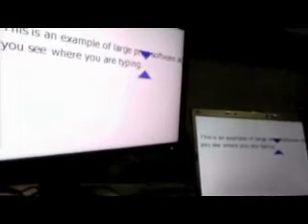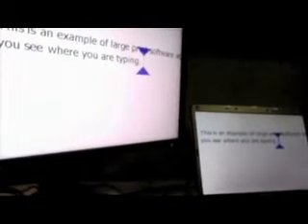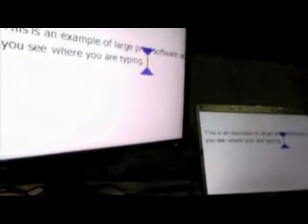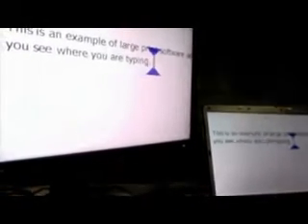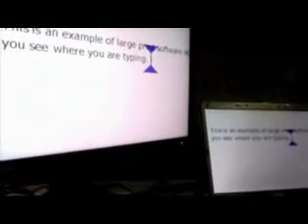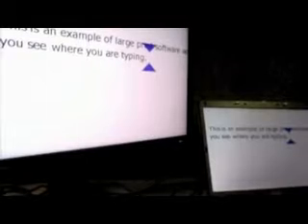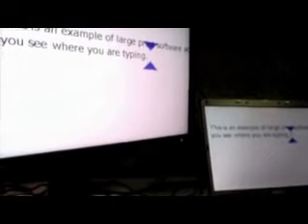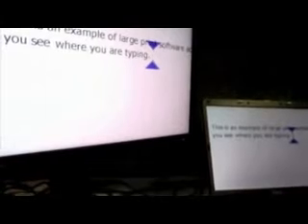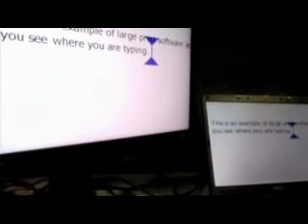Wow. Okay? So again, what we're trying to do is visually keep you oriented, and the whole reason for that is efficiency, because the more efficient you are, and that's why we always go back to touch typing. It's really great if you learn to touch type, because you can just be more efficient that way.